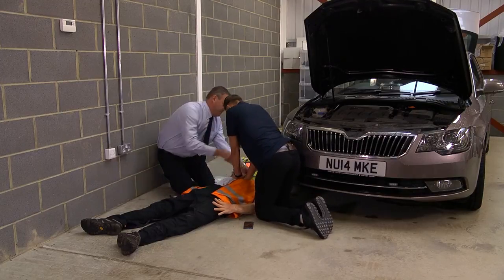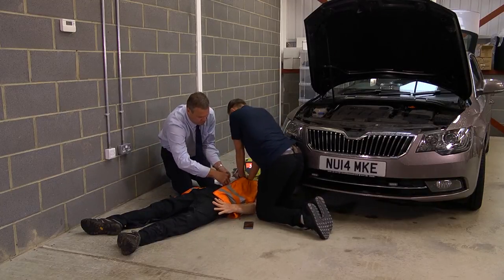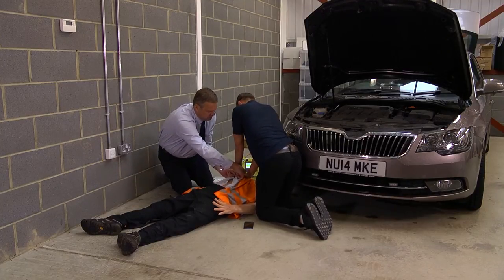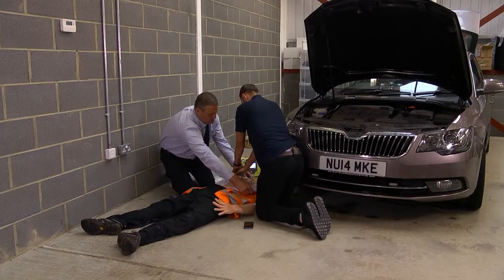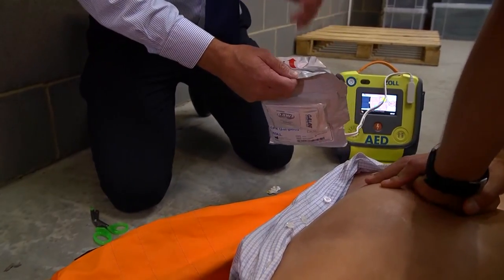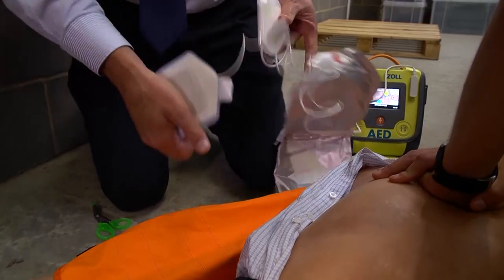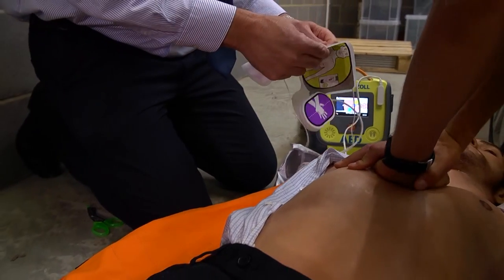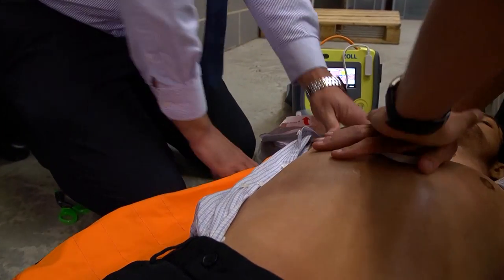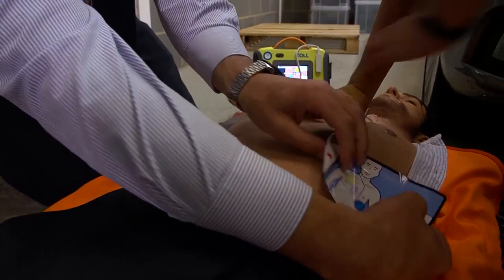Stay calm. Check responsiveness. Okay. Keep going. Call for help. Open the airway. Check breathing. What happened? I just heard a big bang. I found him on the floor. If the patient is a child, press the child button. Attach pads to the patient's bare chest. If you're doing CPR, okay, I'm going to put the pads on the patient's chest. You're doing a good job. Okay, thank you. Attach pads to the patient's bare chest. Okay, stop for a second. Okay, carry on doing CPR on there, please. Yeah, okay. Attach pads to the patient's bare chest. Keep going.